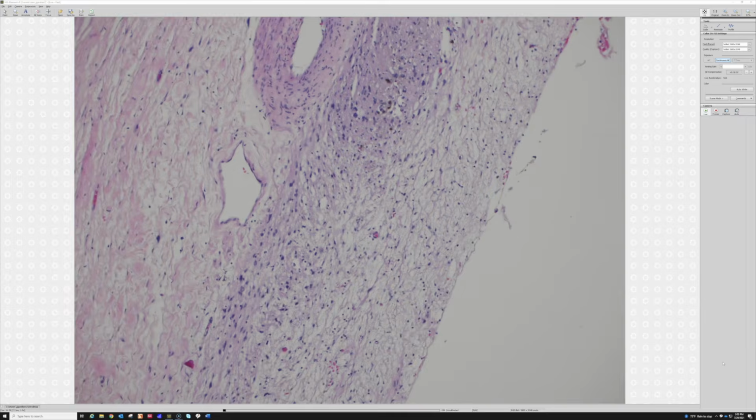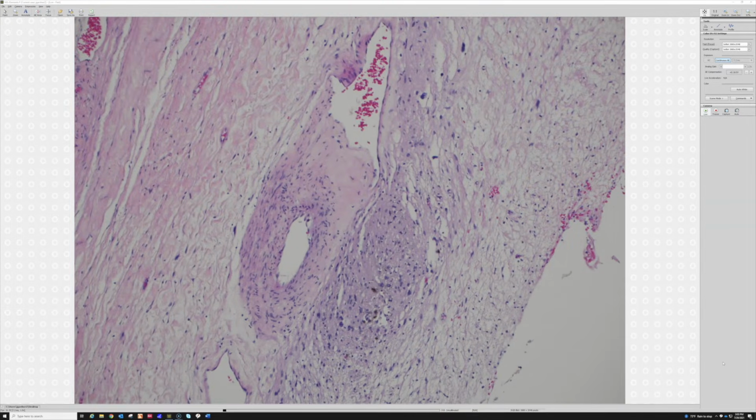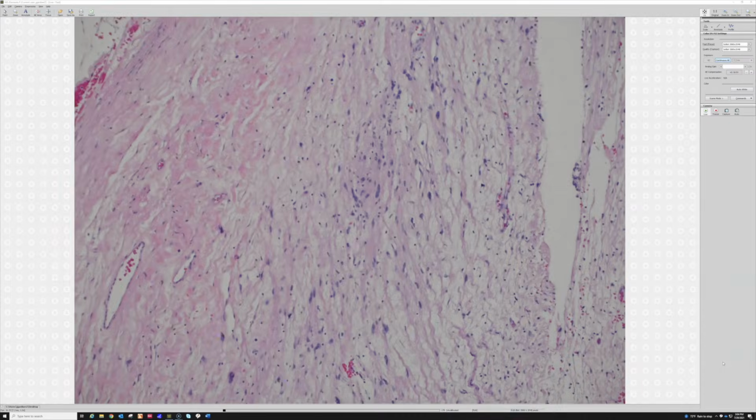And then the other thing is these hyalinized vessels. I find that really helpful, and it's usually present: sclerotic homogenized collagen in the vessel wall. Sometimes it can be very extensive. Sometimes also the vessels leak and they get blood around them and hemosiderin, and they also will get bright pink fibrin in the vessel wall and around the vessel. So you'll have sclerotic collagen and fibrin layered around vessels.